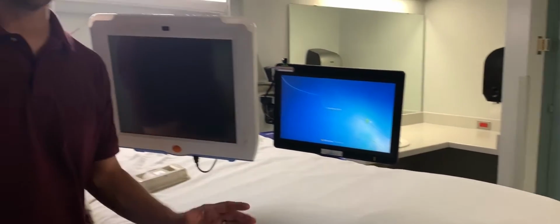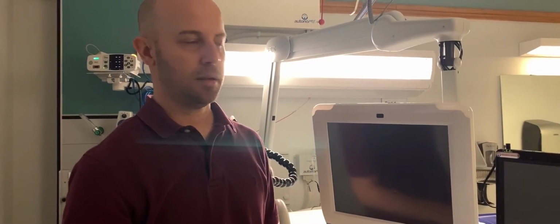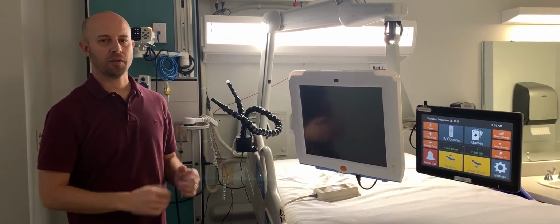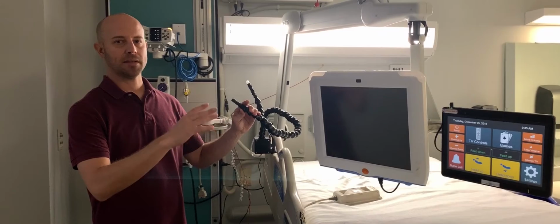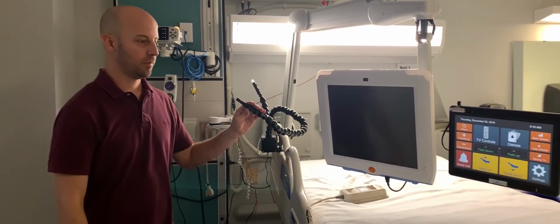Once the computer restarts, you can have the patient test those buttons again by speaking them into the microphone. After you've completed the microphone configuration process, have the patient try again to access some of the buttons that they might have been having trouble with.